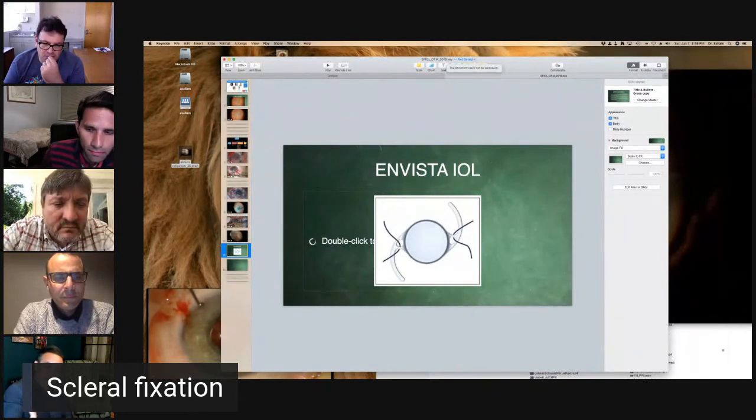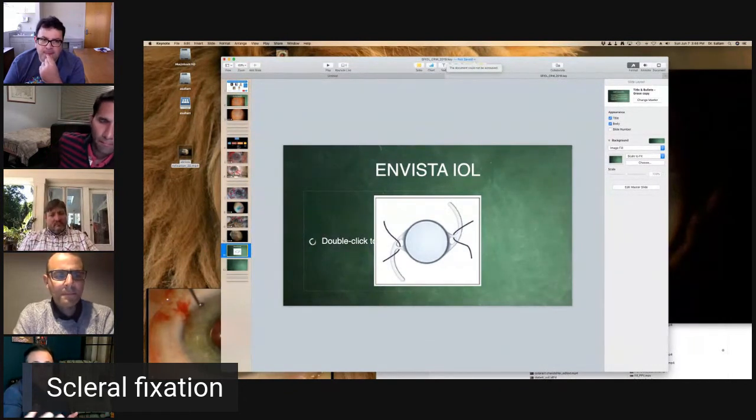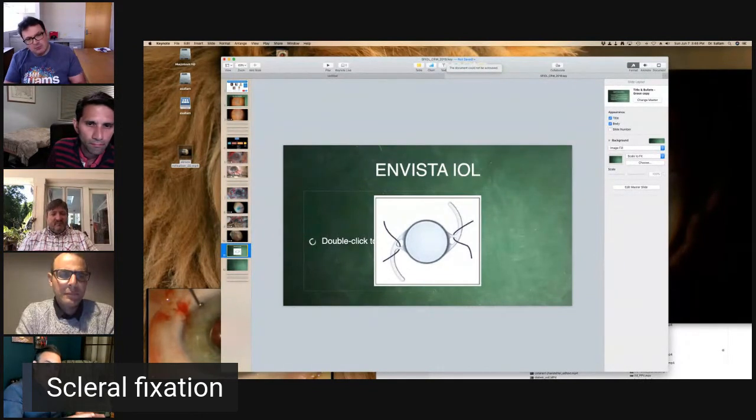Some people worry about having intraocular lenses dislocated in the posterior segment, floating about. I've not seen anyone that had a perforated retina or anything from any dislocated lens. I don't know if you've had that experience, but I also think that if the patient is elderly and able to cope with a contact lens and they don't want more surgery, a lens in the posterior segment is not always a crazy option, as Aman said.